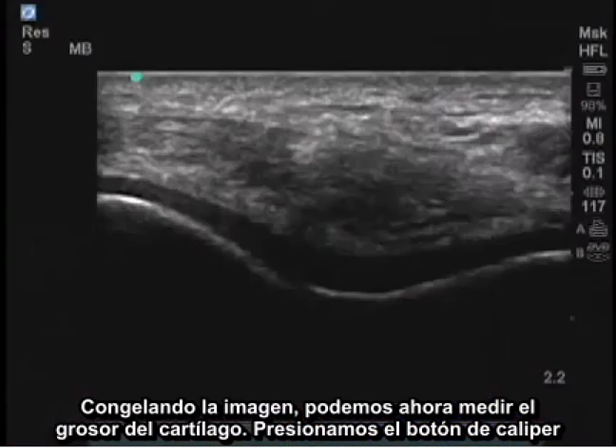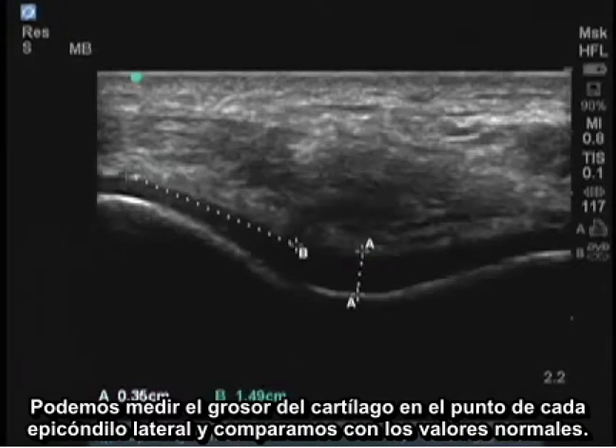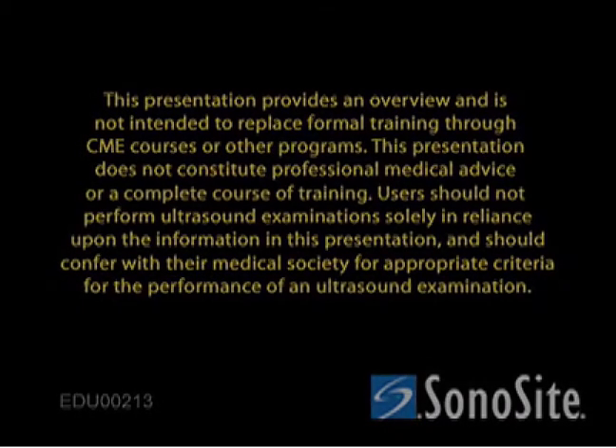By freezing the image, I can now measure the cartilage thickness. I press the caliper button, locate the center of the cartilage, and measure the distance of cartilage thickness. I can measure the cartilage thickness at the point of each lateral condyle and compare these to normal values.